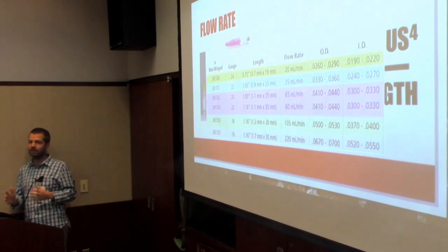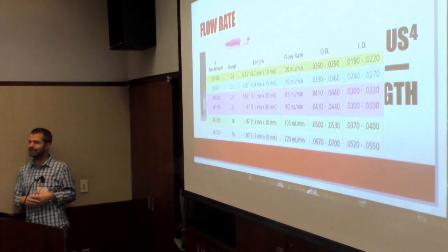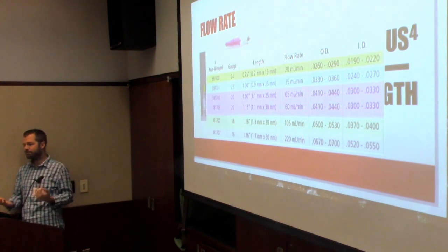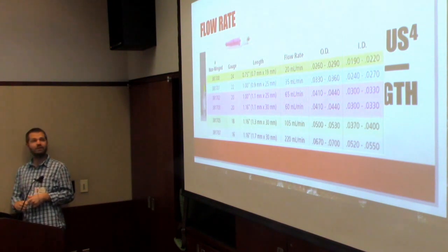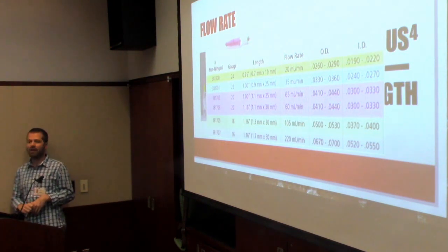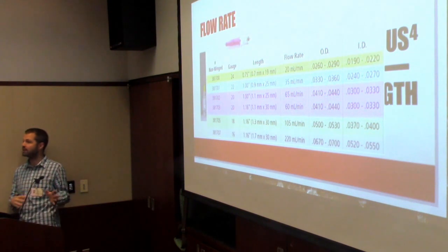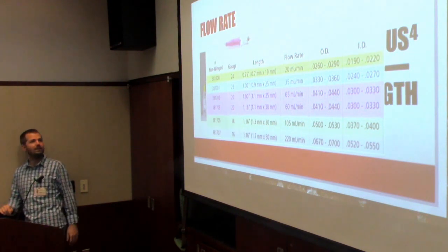So if someone asks for an 18 gauge, think about how big your patient is and whether they actually need one. If your person weighs 35 kilograms and they say you need an 18 gauge, you can say the person's tiny, what's the max flow rate you need? And they'll often tell you. And you can say, oh, I put a 20 gauge in, that covers the flow rate you need. I've used that argument in peds, and it's actually worked, where they want a certain gauge, and you say that's not actually correct for this size person. They don't actually need it.